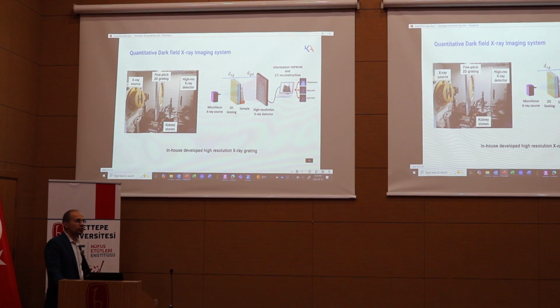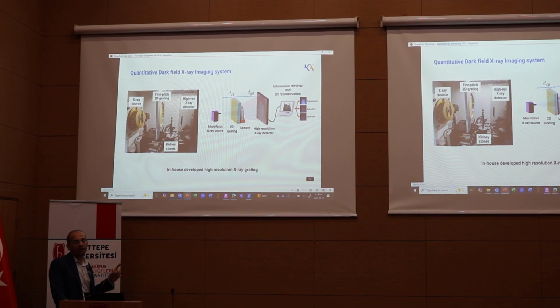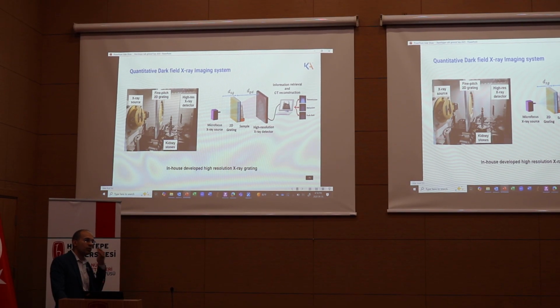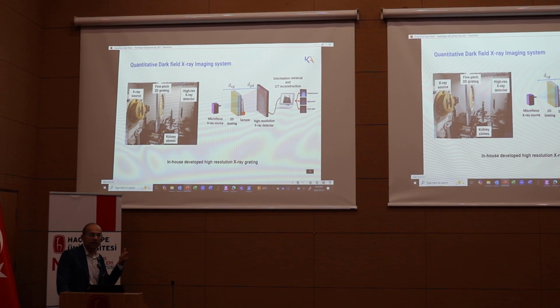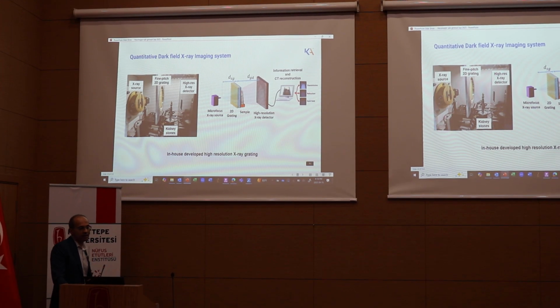So, I showed you phase contrast, and you can see more, but I teased you with a line right at the beginning. I said, we can do quantitative imaging. And so you would have asked, well, what is quantitative about phase contrast? Like the phase helps you see the low density material. So I've got better visualization, but what's the quantitative element? So this is where the quantitative element comes in.